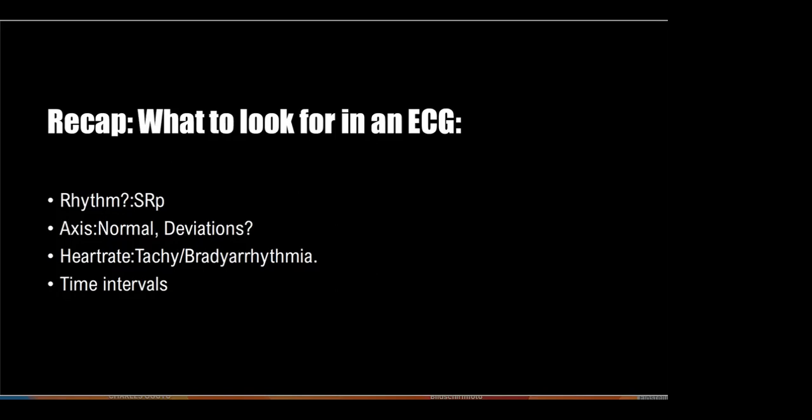Anybody who listened keenly last week? Oh, you guys slept. I will just summarize how to find out that your ECG has a sinus rhythm.